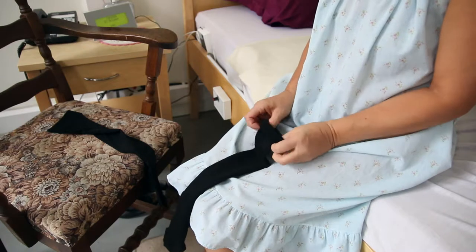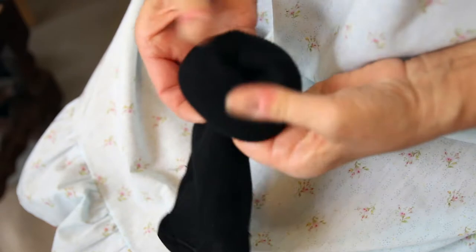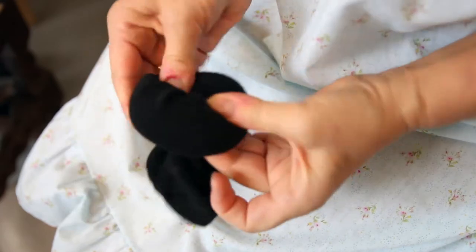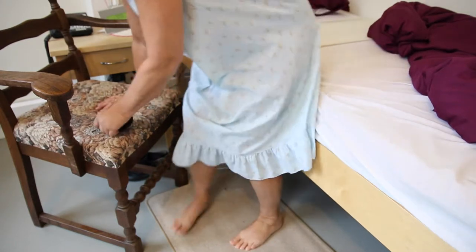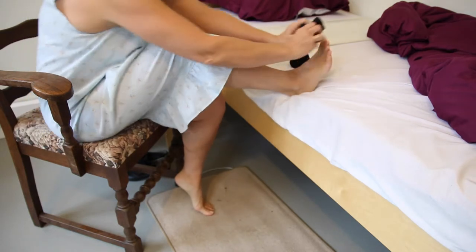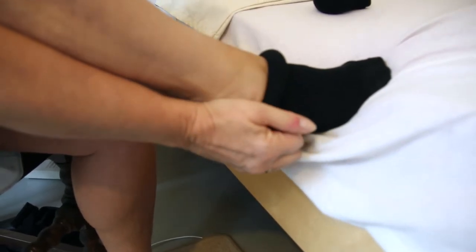First, you roll down both stockings like this. This will make it easier to put on. Let's start with one foot. You put on the stockings like this, and then roll it all the way up.